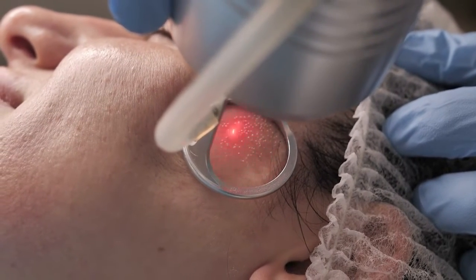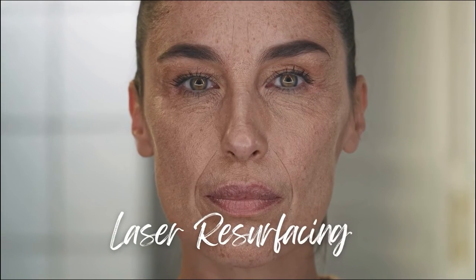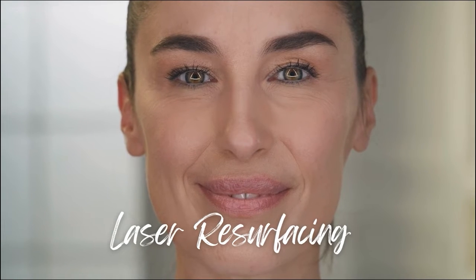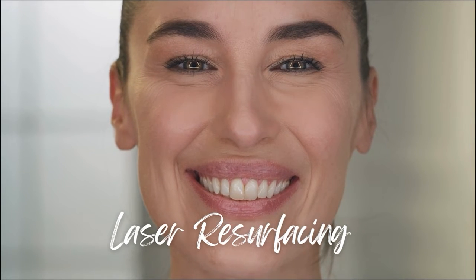So that's it for our carbon dioxide laser, you guys. We did a total combination resurfacing for our patient here while she's awake. She's going to have an amazing result, 7 to 10 days downtime. But her skin is going to be so youthful, so tight, and much improved compared to where she started. Let's see how she looks in 3 months after 5 sessions.